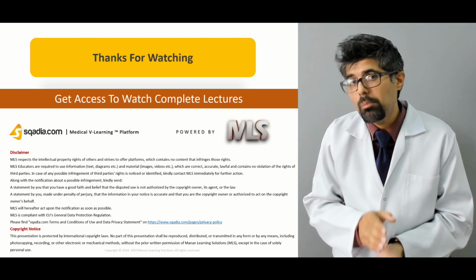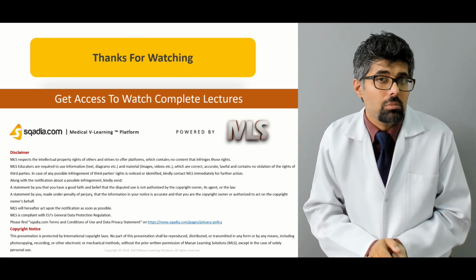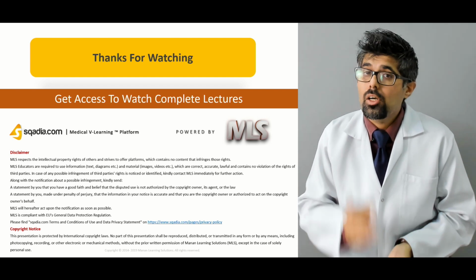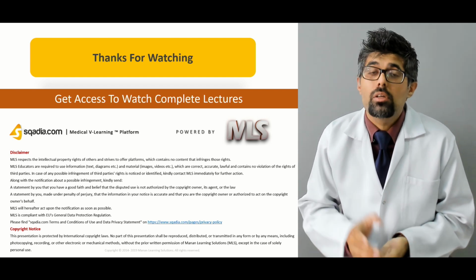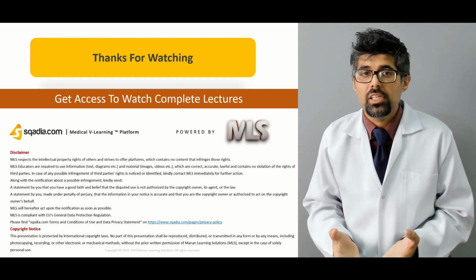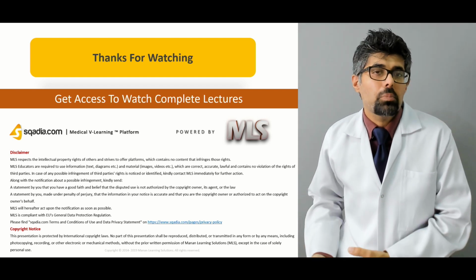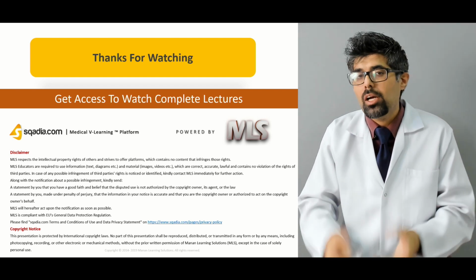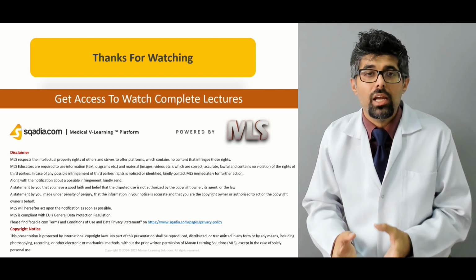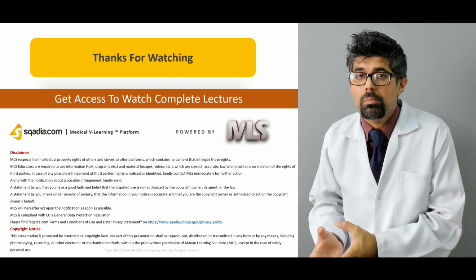Now, these were the important ones where we learned about the calcium scoring system. We learned about the CCTA, the arteriogram. We learned how important it is, how non-invasive it is, and how much we can gain from this simple test. Now, instead of regular angiography, we can simply perform a CCTA and we can judge which treatment plan to follow.